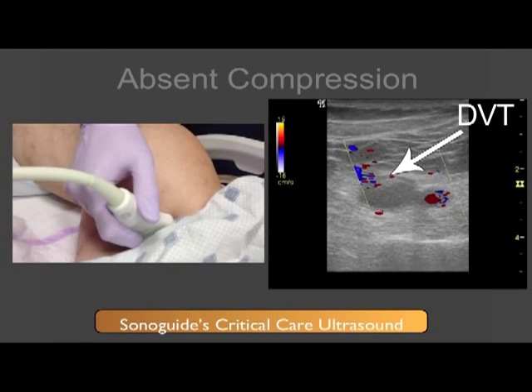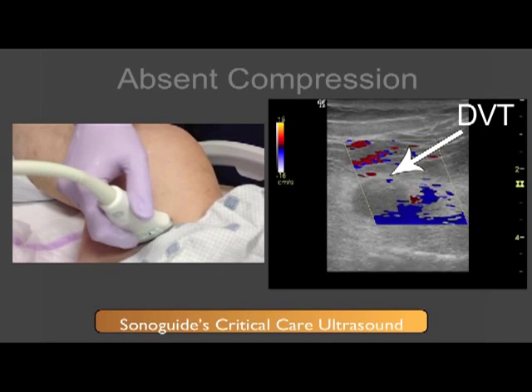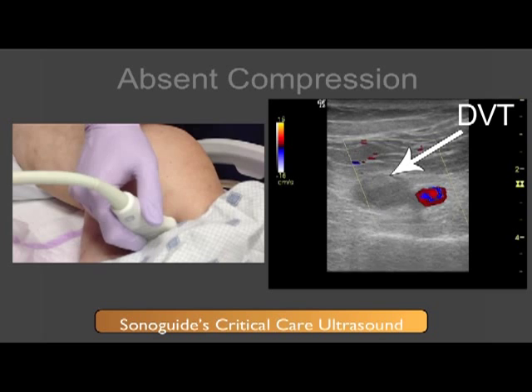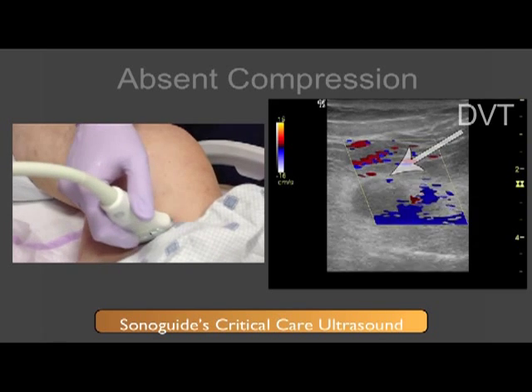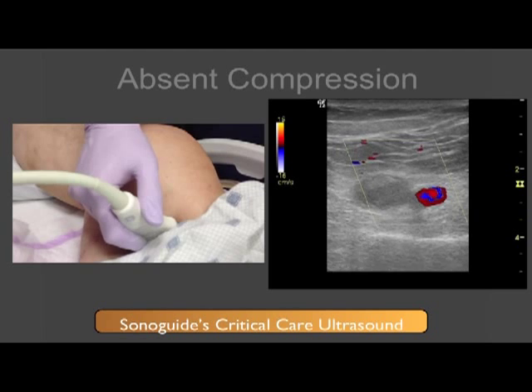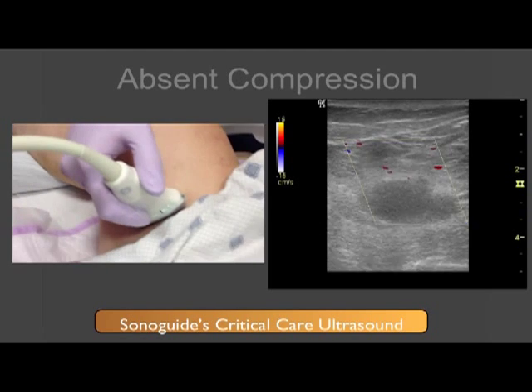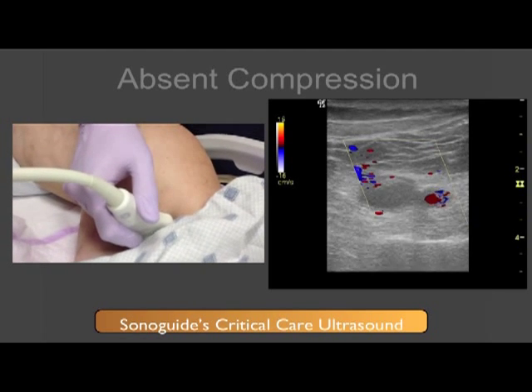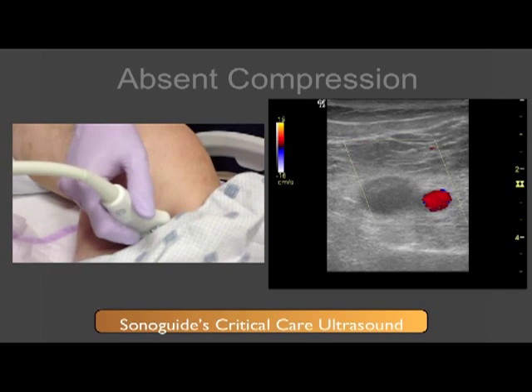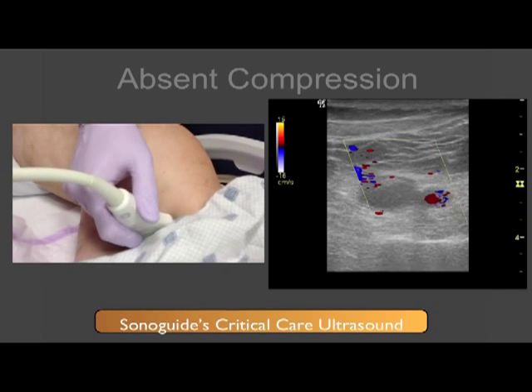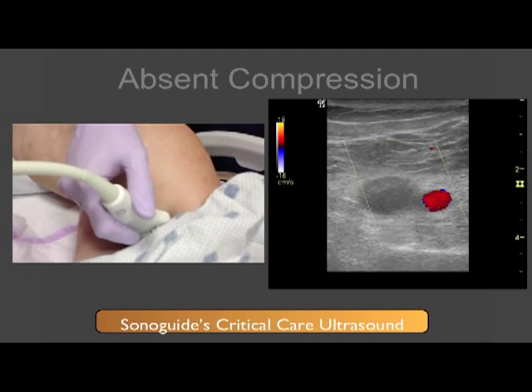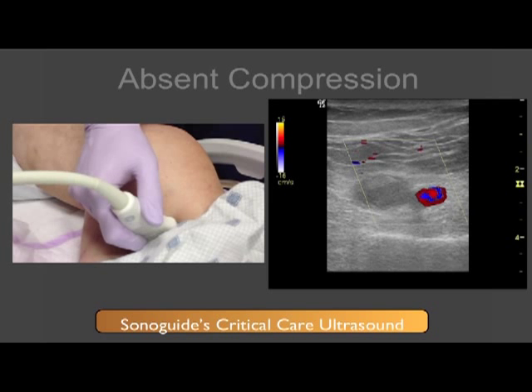When a DVT is present, you will note that the vein does not compress as easily. In this image, note on the right side of the screen the vessel is resistant to compression compared with how much pressure I am applying externally, as noted by the left side of the screen. In fact, you will note that the artery begins to compress, whereas the vein does not. Please note that this image shows color Doppler, which demonstrates pulsatile flow in the common femoral artery.